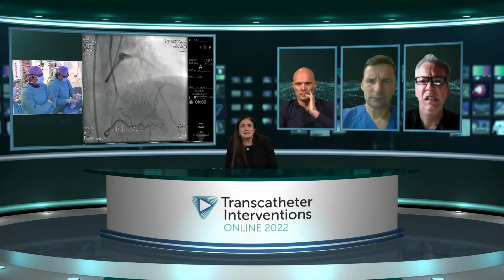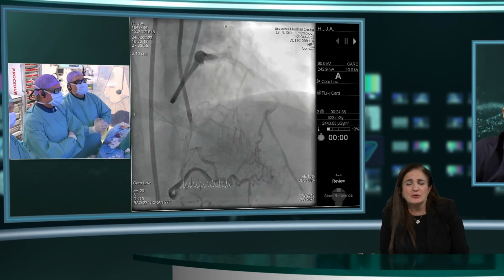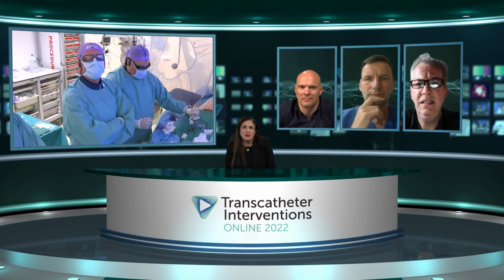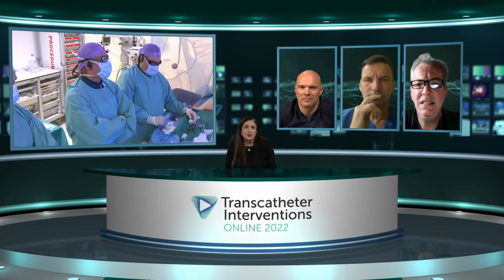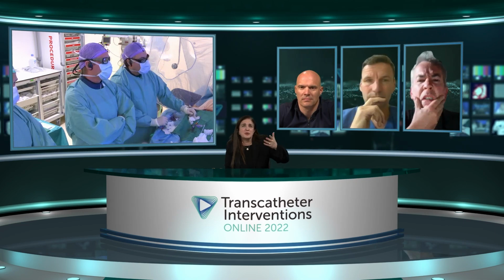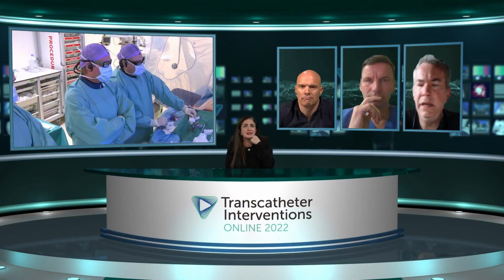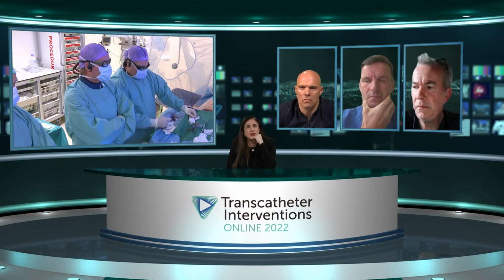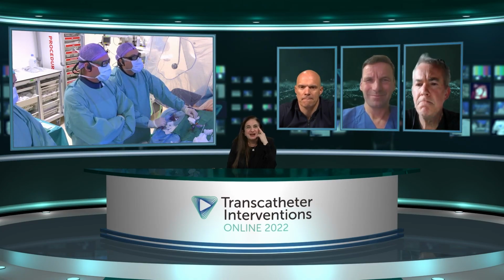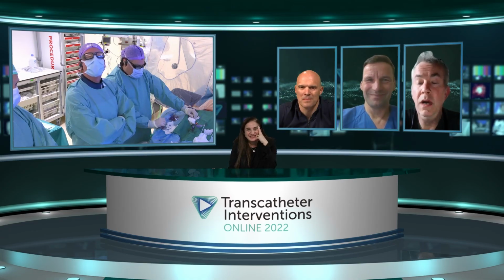Wow, difficult case, fascinating case, actually. So, David, let me go to you first. How would you approach something like this now? I mean, it seems to me that the orbital atherectomy probably caused some damage there. You were very careful to come to the ostium and probably didn't stent into the left main. There was probably some contained perforation or dissection, but obviously we see a little bit of an aneurysmal dilatation there. But we just talked so much about antegrade approach. Now let me hear what this team wants to do first. David. Well, a couple of things, I think.